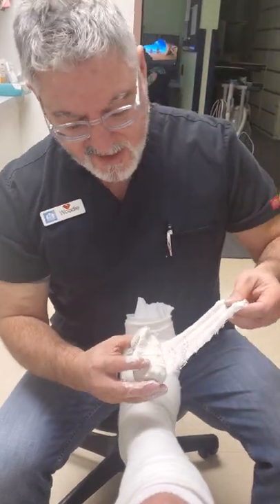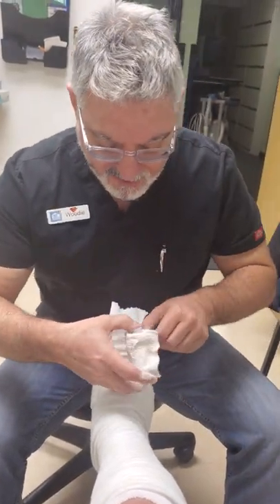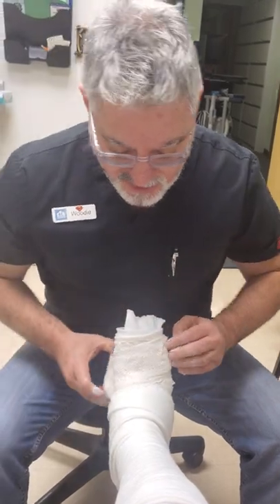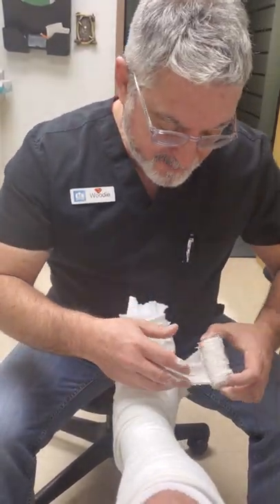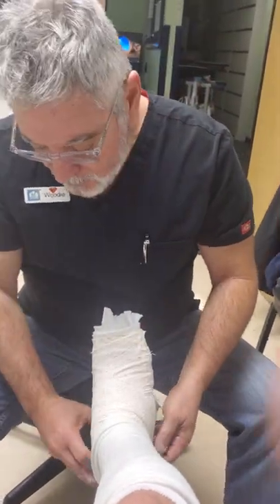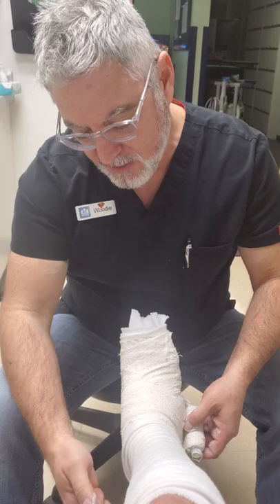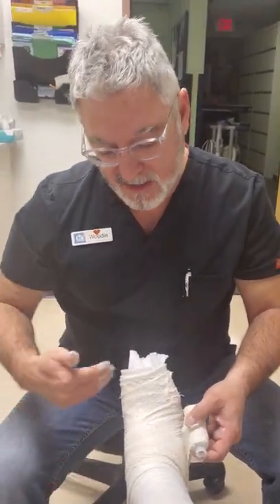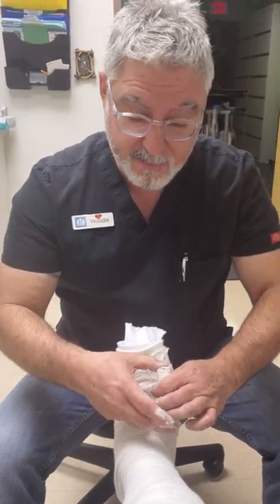So we're going to take the rolls and start making the cast now. As you can see I've gotten rid of the excess water. Unlike fiberglass, you can get a little bit more creative with plaster — it rolls entirely different. You can work with it as you come around the bends and angles. You can rub out the wrinkles. If we were doing strips, we could do strips around the posterior of the foot and posterior leg to create what they'd call a reinforced posterior spine, put that underneath and then roll on top of it to create a really sturdy weight-bearing plaster cast.